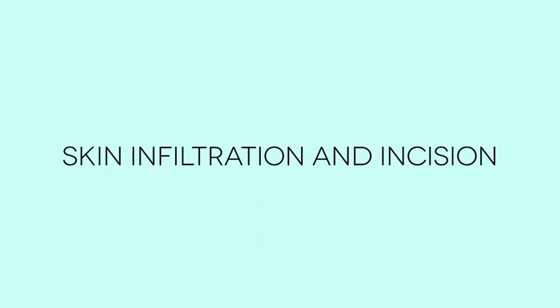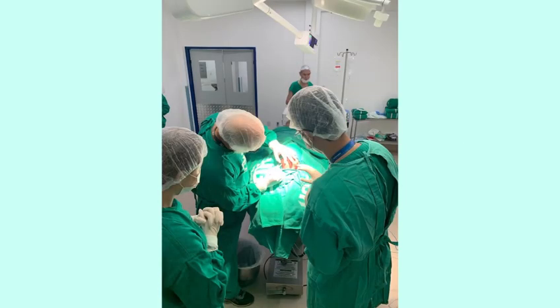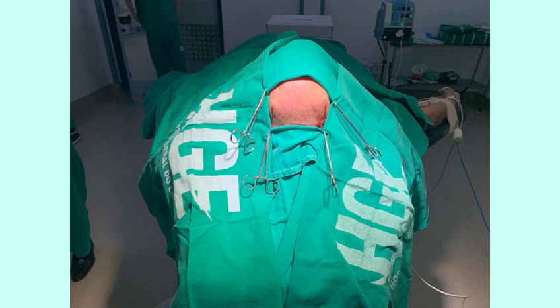4. Skin infiltration and incision. Infiltrate the skin with lidocaine containing epinephrine for better skin hemostasis. The incision should only be approximately 5 mm long. A skin retractor is not needed. 5. Twist drill skull perforation.